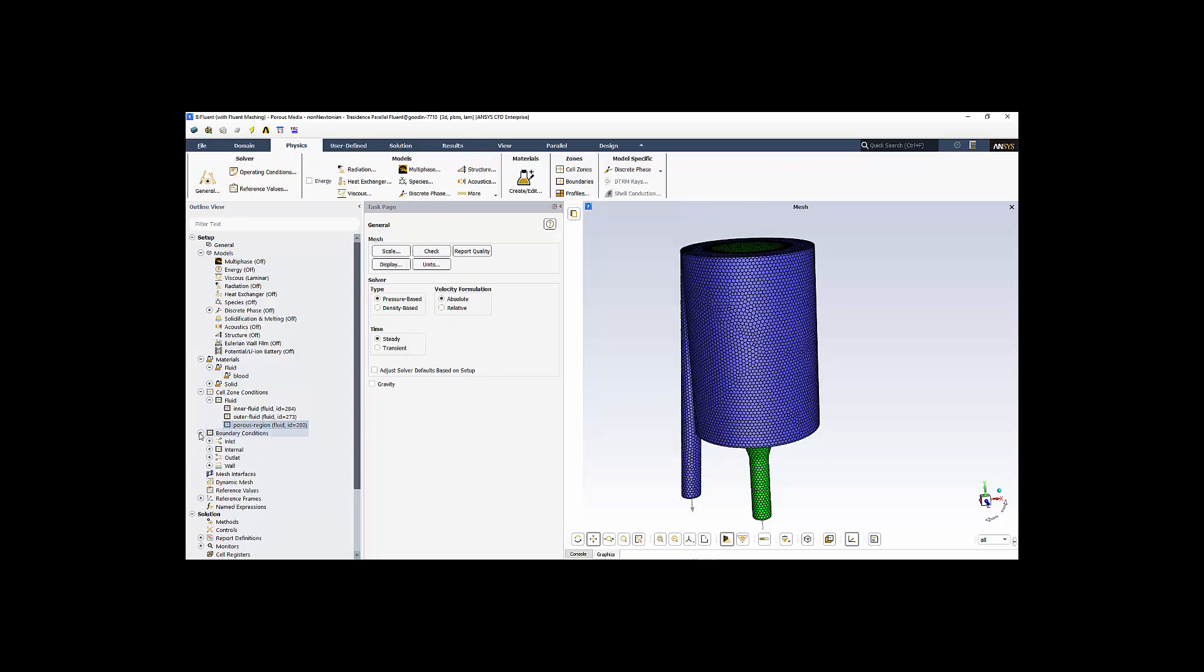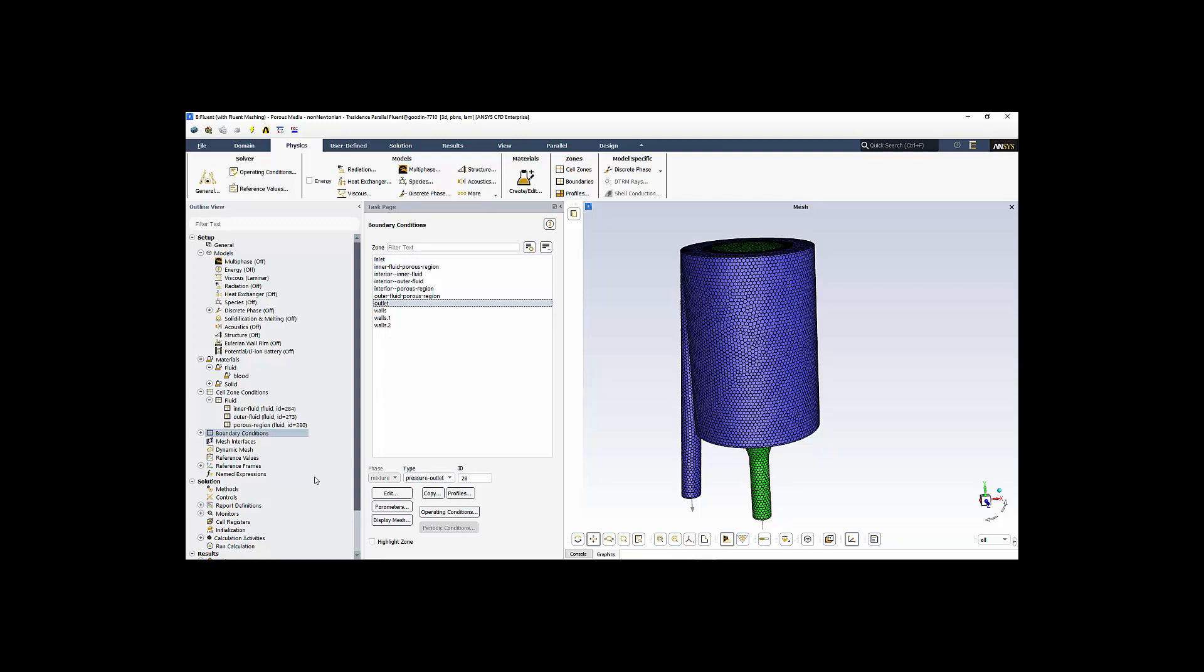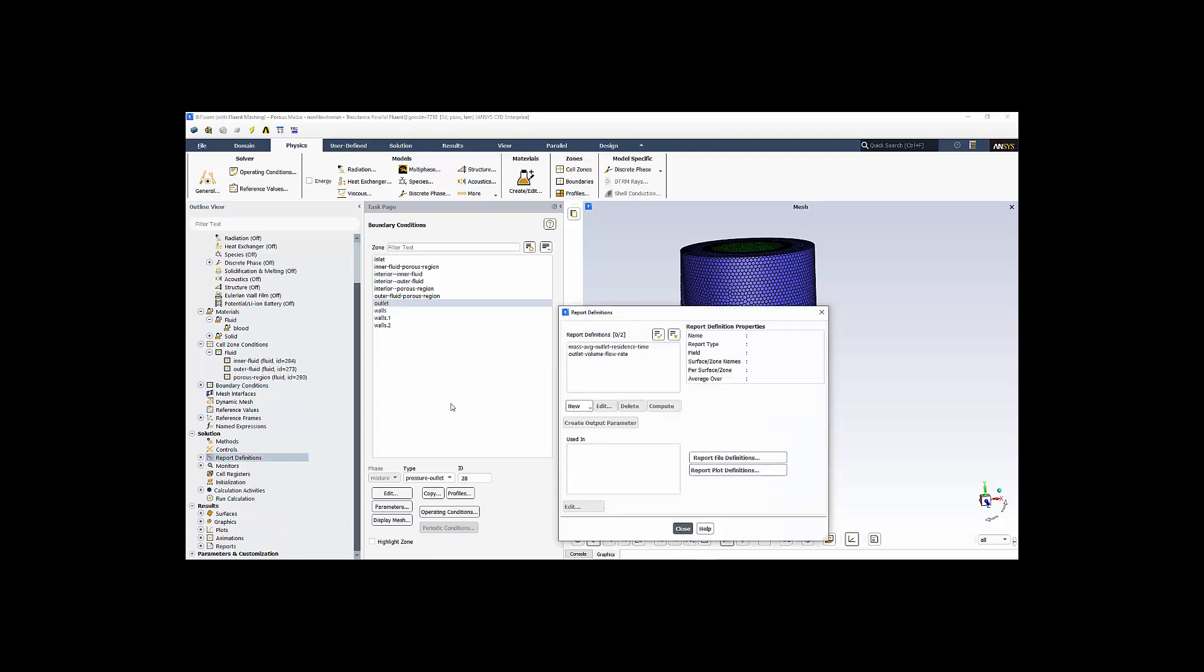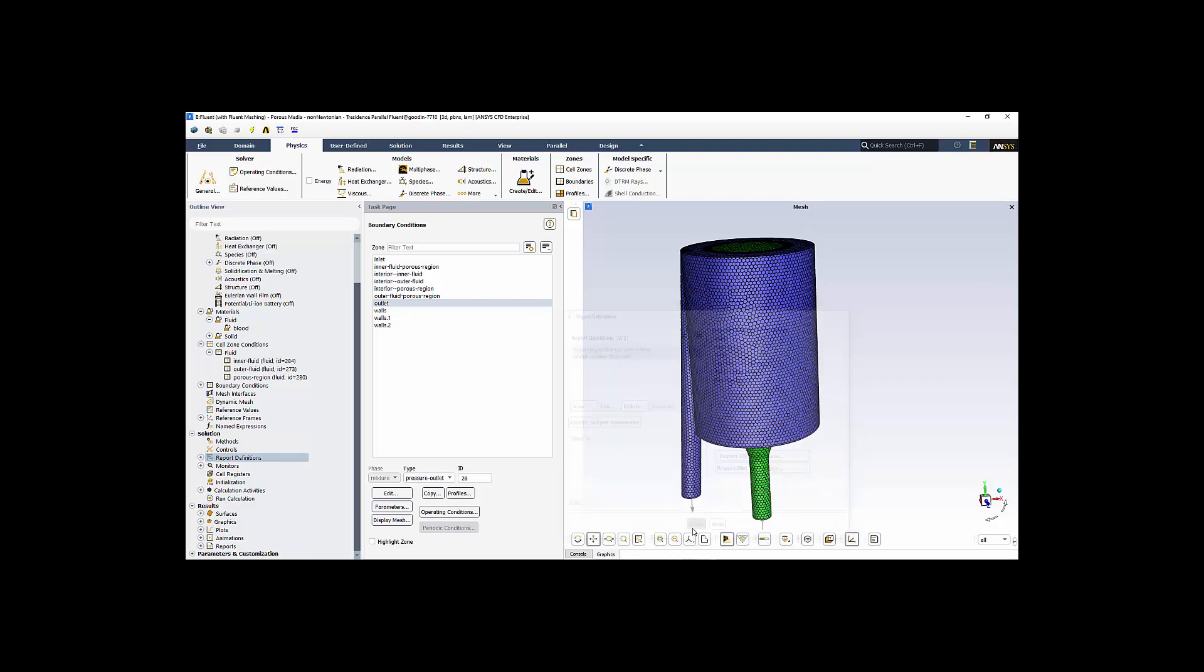Boundary conditions is next. We double-click on boundary conditions. They are listed for us here. We have an inlet. We're using a mass flow inlet. We have an outlet. It's a pressure outlet. Specify a constant pressure. We have interior surfaces between the different regions. And we have walls. With that done, we're really ready to run. I did include a couple of report definitions. Those are to determine the mass average outlet residence time and the outlet volume flow rate. Just to monitor my solution as it progresses.